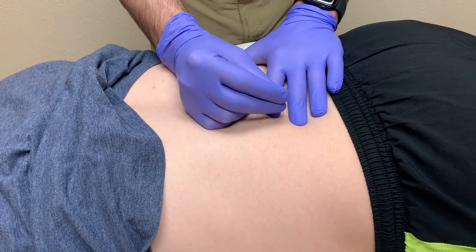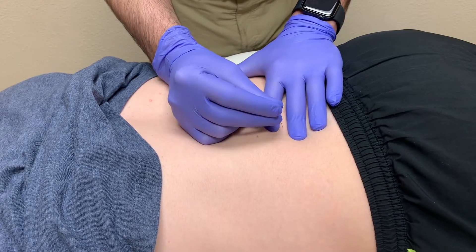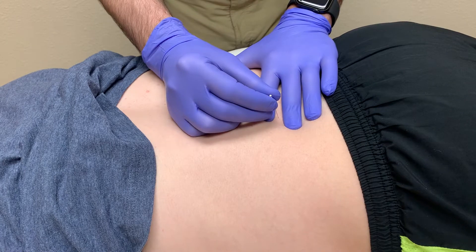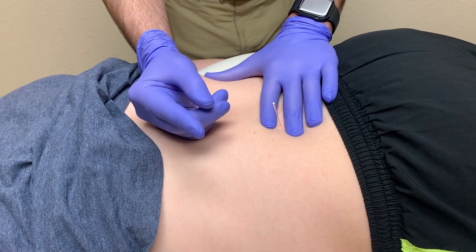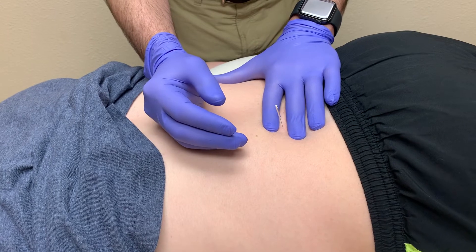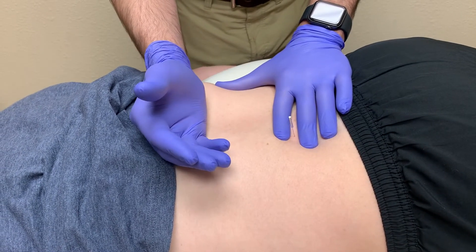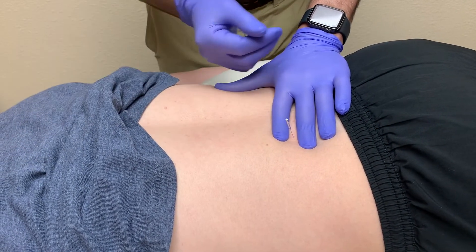As the name implies, it is fast in and out — you're advancing the needle and taking it out quickly. This is great for muscles that have very little resistance to the needle being advanced in or out, and it's great for eliciting the twitch response. One of the disadvantages — actually two disadvantages — is that this is a little bit more aggressive and tends to make your patients more sore afterwards, especially if you elicit more twitch responses. The other thing is as you go in and out so quickly, you have a hard time detecting any change in tissue texture or patient response other than them verbally telling you that they have symptoms.